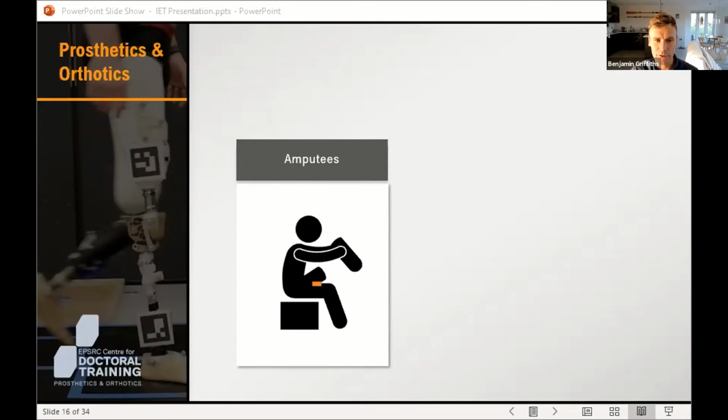Obviously, this is dependent on the type of amputation and the type of prosthesis being used, but we wanted to develop a method that was applicable to all lower limb amputees. Also, the method used to mount the activity monitor on the thigh involves this sort of sticky covering plaster, which can quite often come loose and fall off, and in general, some people are just opposed to the idea of being monitored. So there could be social issues with having an obvious monitor attached to their leg.